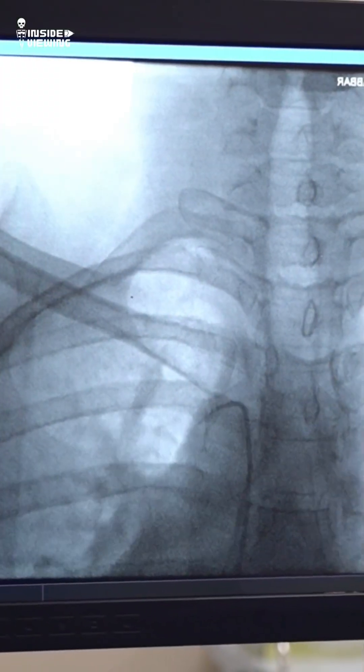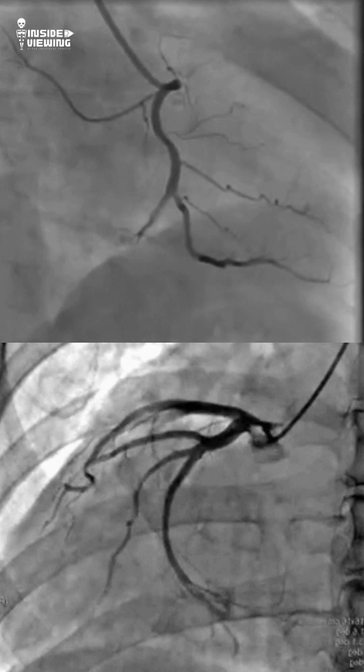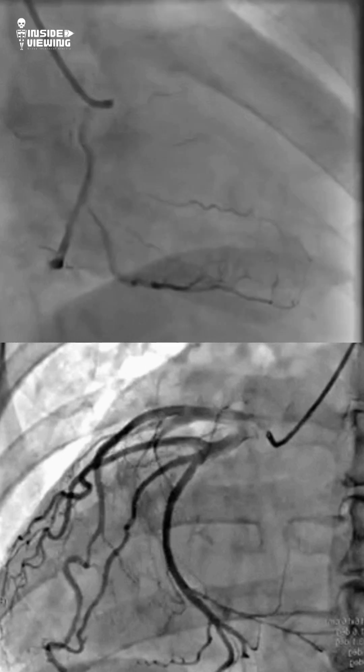First comes angiography — a special x-ray with contrast dye that shows exactly where the blockage is in the heart's arteries.